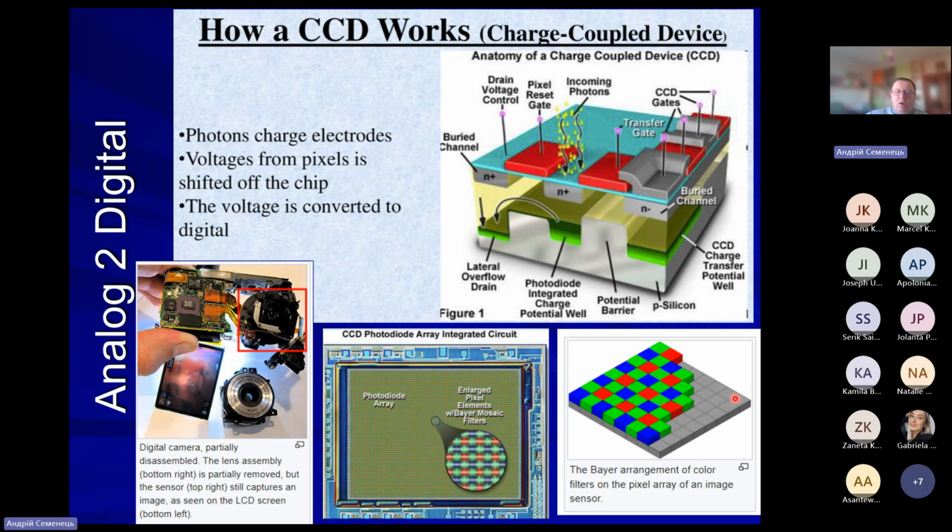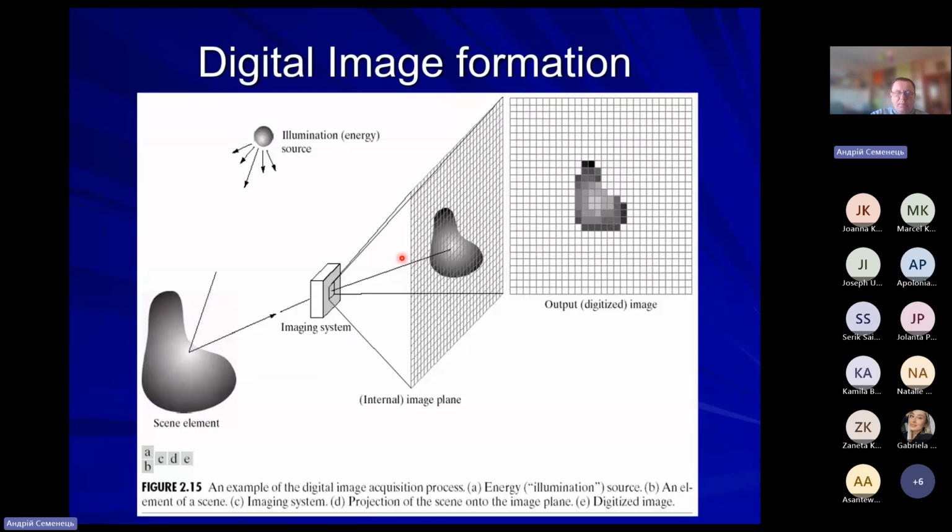Okay, so once we are given some voltage level from a pixel, after that it has to be processed by a digital computer or a digital ADC unit in order to convert it to a digital representation of this pixel. And after that we will be able to talk about a digital image. So here is practically how any digital image has to be created.